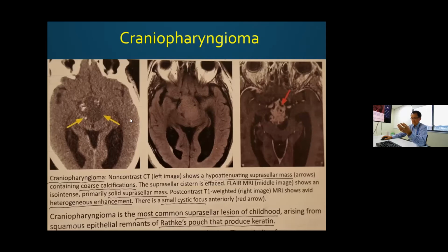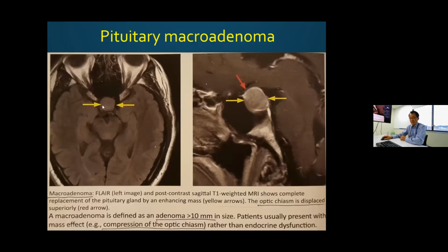And the pituitary gland right here is well defined. Is it a microadenoma versus a macroadenoma? Greater than 1 centimeter is called a macroadenoma. Soon after you see this kind of thing, you have to check the hormones produced by the pituitary, the anterior and posterior gland.